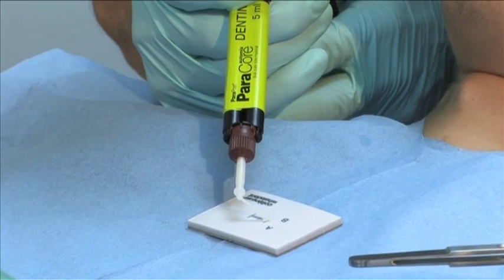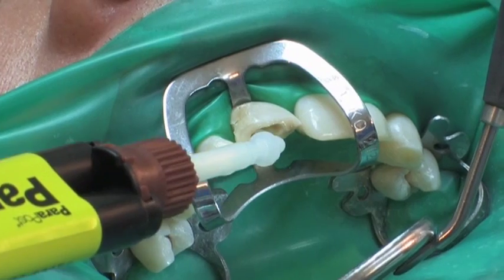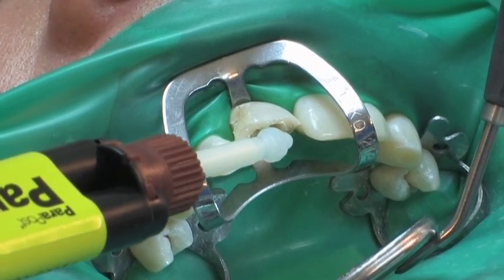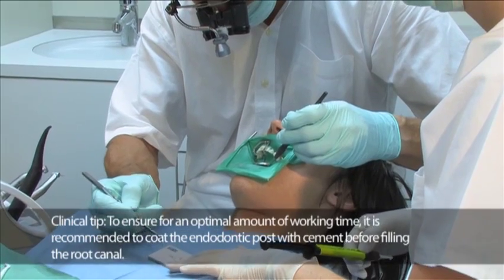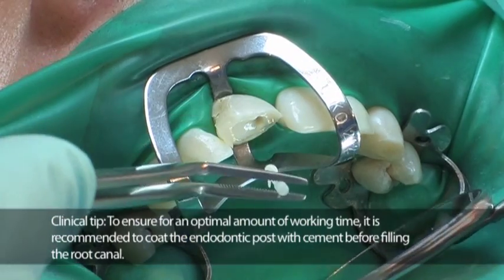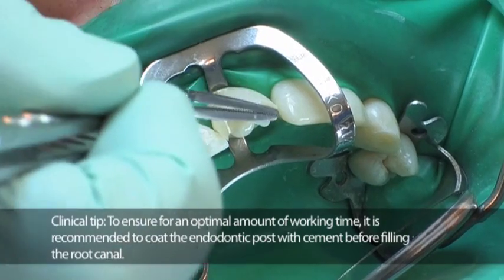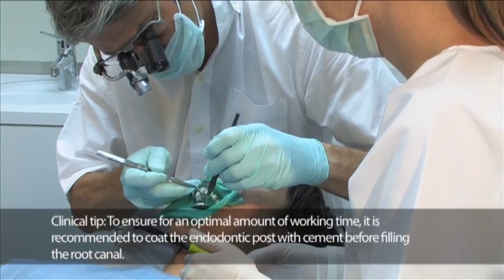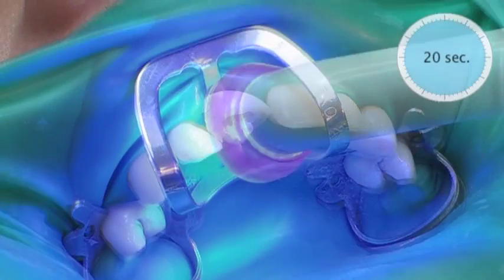The convenient curved root canal mixing tip allows ParaCore to be applied directly into the root canal. The untreated post is coated with ParaCore and cemented into the root canal. Since ParaCore is dual cured, the curing light can be transmitted through the glass fiber post, reaching the ParaCore material in the apex to accelerate the curing process.